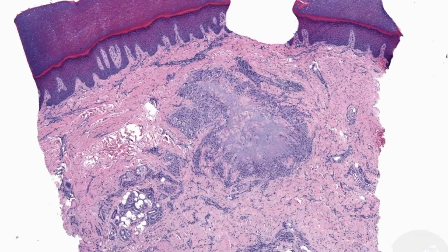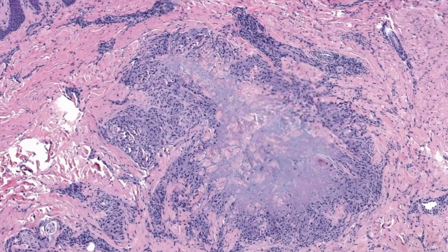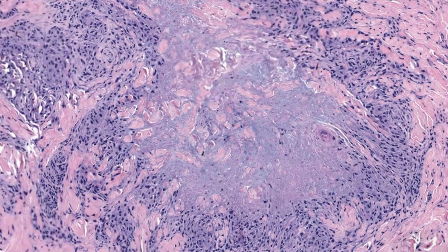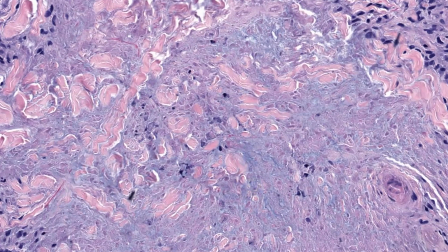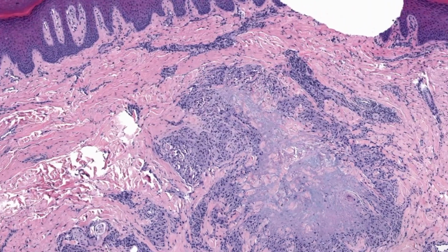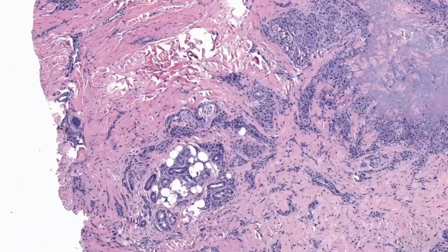You can see a skin biopsy over here, and you can see that there is definitely a palisading necrobiotic granuloma, which can be identified here. There is a granulomatous area over here, and what do you see in the center? This is something which is bluish in appearance, and surrounding cells are all histiocytes. So in this bluish area, you can clearly appreciate collagen bundles intermingled with bluish mucin. So this is a case of granuloma annulare.